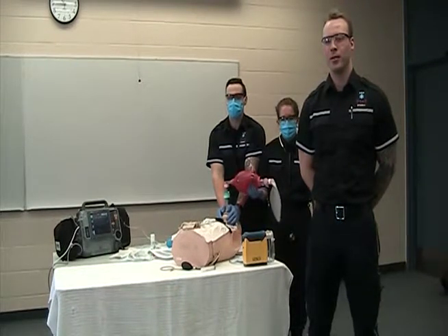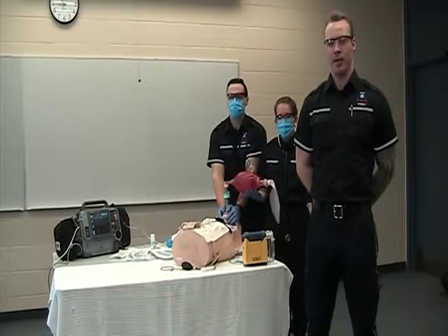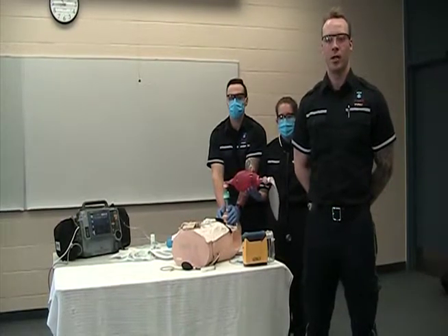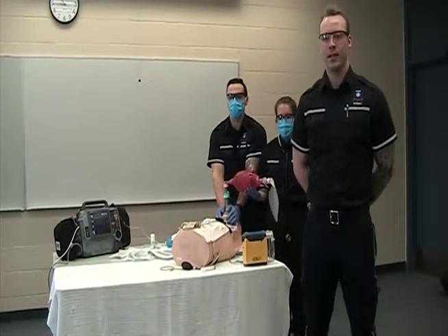So first thing we need to do before we intubate the patient is we need to prepare them. So first thing is ramping. We've got to provide a pillow or blankets, anything to get the patient into sniffing position and provide the ear to sternal notch position, so we want to align the oropharyngeal and laryngeal axes.